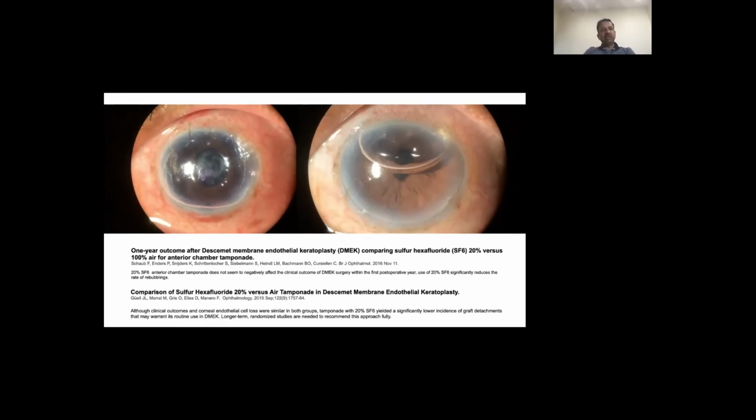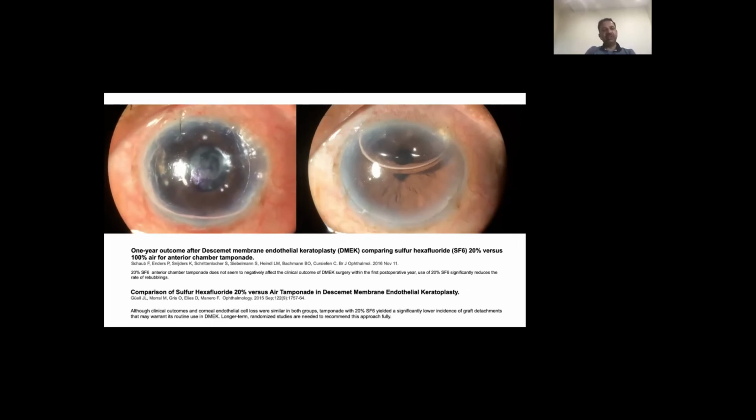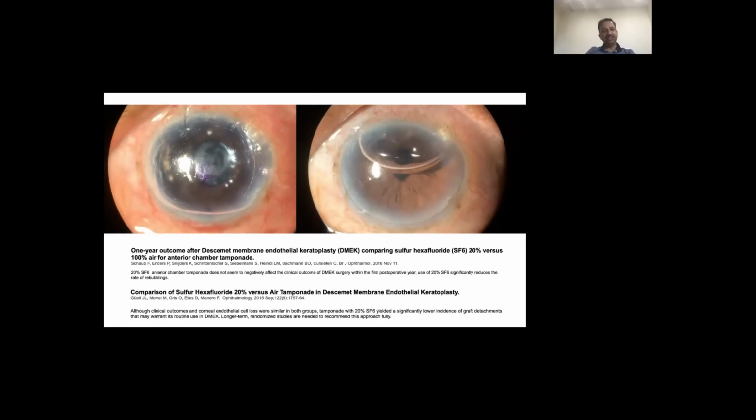Post-operatively, I still see my patients an hour later, even if I have an inferior PI, just to make sure I see that small meniscus of fluid, because sometimes in a soft eye, you can overfill the anterior chamber, and even the inferior PI, if it's not at the extreme periphery, can get blocked, and you can have some element of pupillary block, so you may have to release some air.